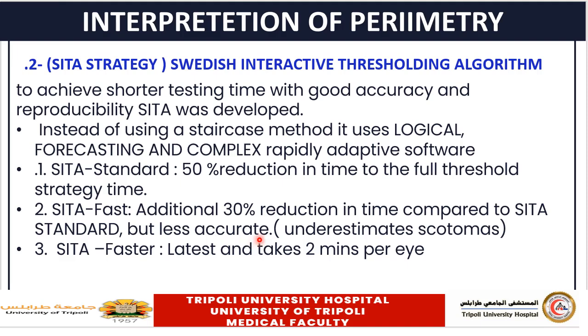And recently, the very fast strategy is SITA faster, which takes about 2 minutes per eye, and this is mainly for screening purposes rather than exact diagnosis.